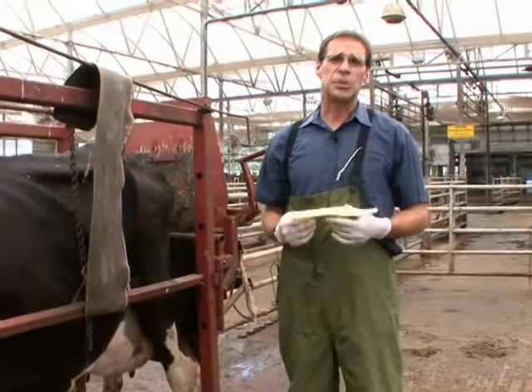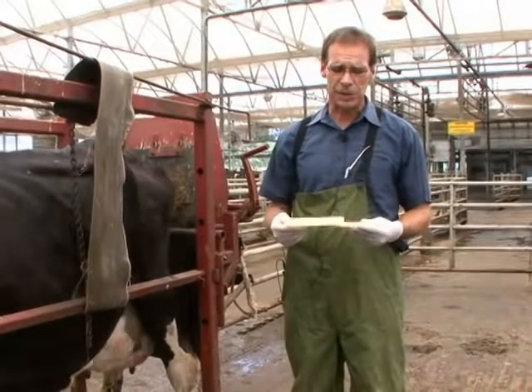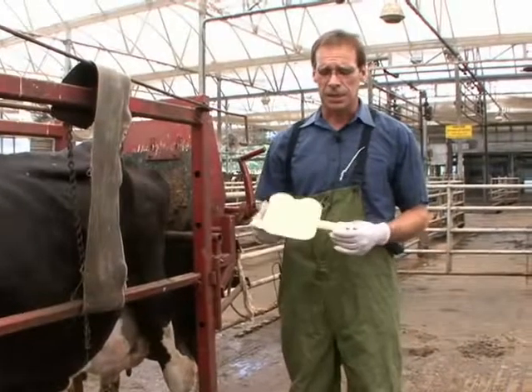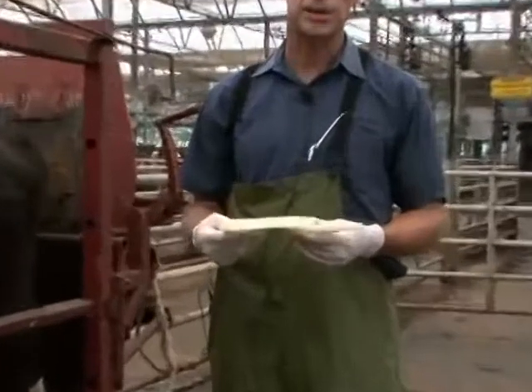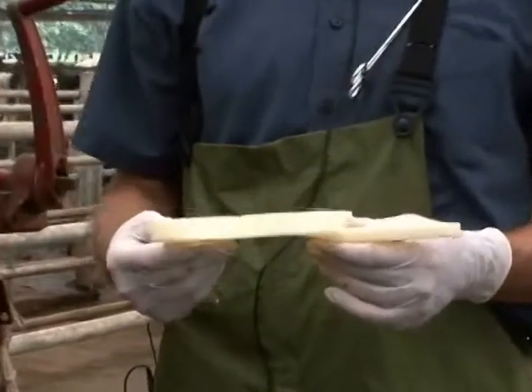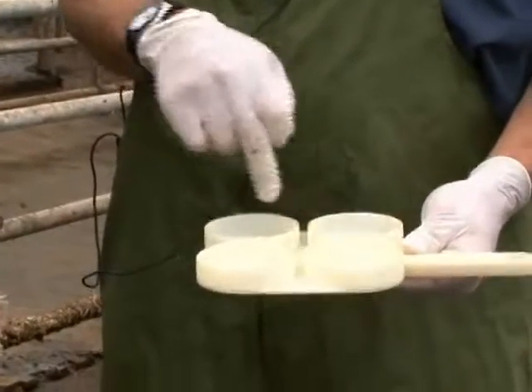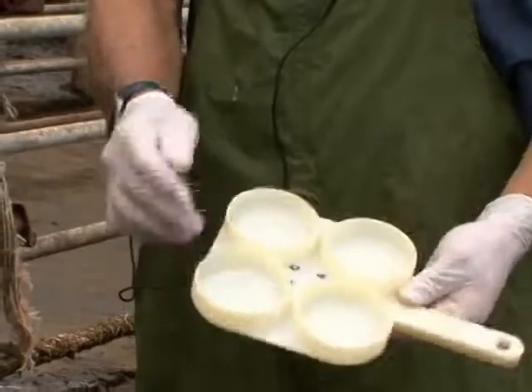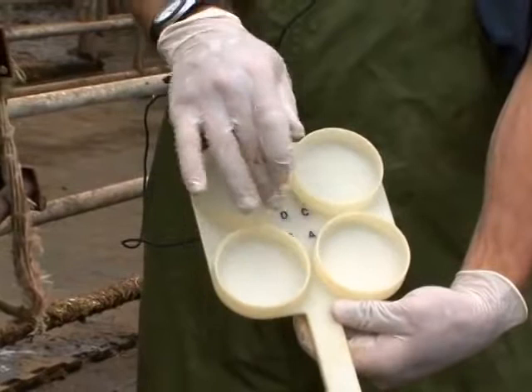So in order to determine if cattle have subclinical mastitis, we use a cow-side test known as the California mastitis test. This is the paddle that we use to determine whether or not these animals have a high somatic cell count in their milk. Each one of these separate wells signifies a different quarter on the cow. You can see each one of these wells is labeled by a different letter.